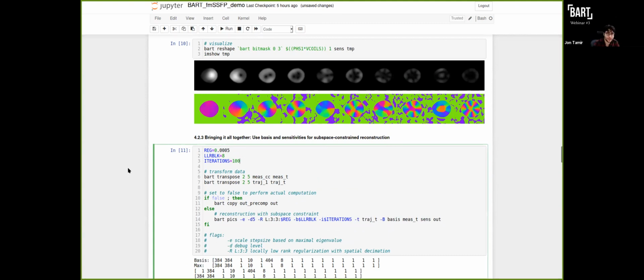Yeah, that's a good point. Also, when moving to these subspace recons, compared to a single static image, you generally do need more iterations for convergence because your problem size is getting bigger. So that's just another thing that you generally will see with dynamic imaging. Thank you.